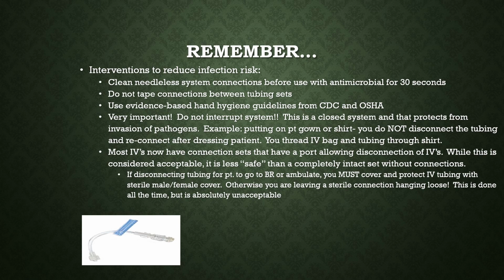Okay, remember, interventions to reduce infection risk. Clean a needleless system before use with antimicrobial. Yes, scrub the hub, or use the little hub caps. Do not tape connections between tubing sets. If you've got multiple sets of tubing that you've hooked together, they should fit well. You should never have to tape them. They shouldn't be loose. If they're loose and you have to tape them, there's something wrong. You don't want to do that.